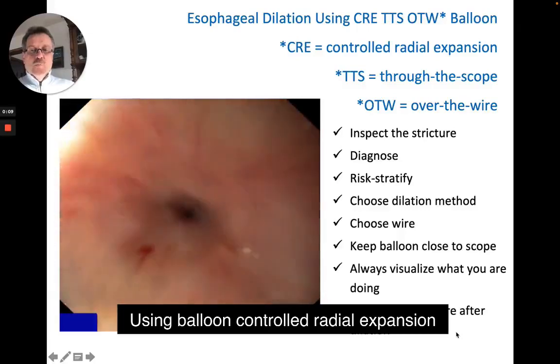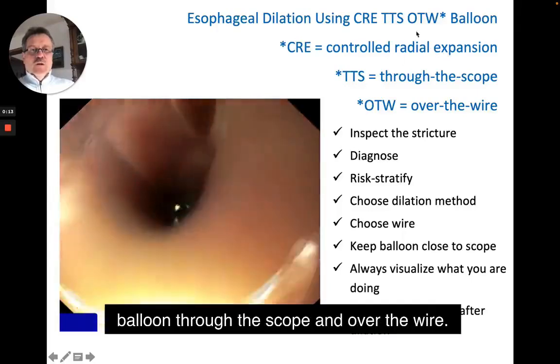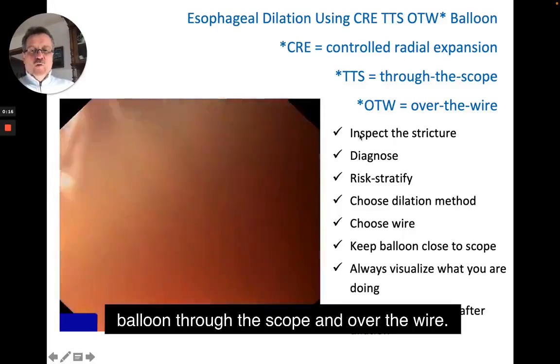Using a controlled radial expansion balloon, through the scope and over the wire.